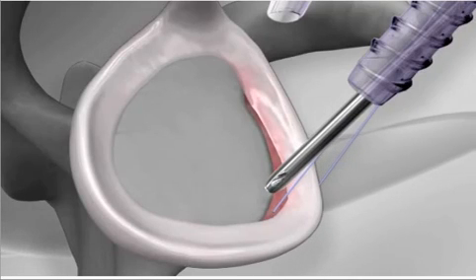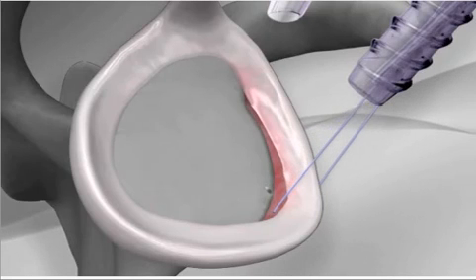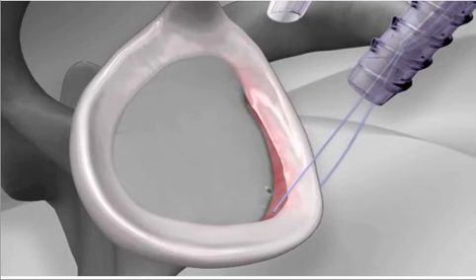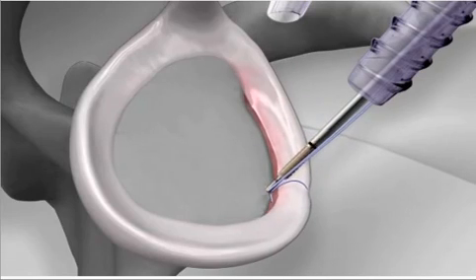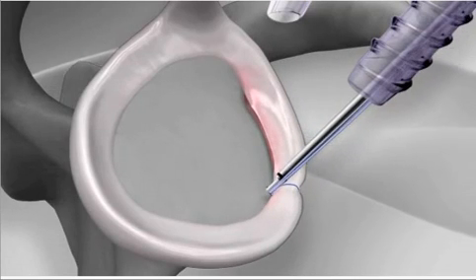The drill is used to create a bone socket on the glenoid. The sutures are fed through a knotless push-lock anchor, and the anchor is hammered into the socket, securing the labrum to the bone.